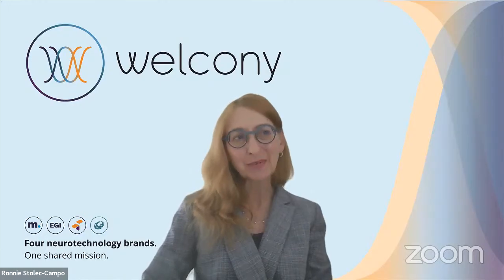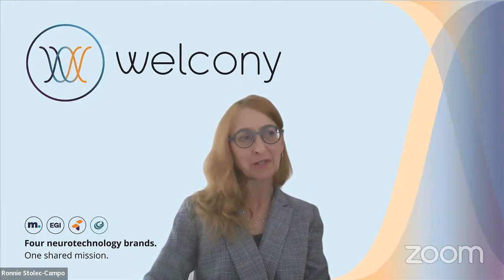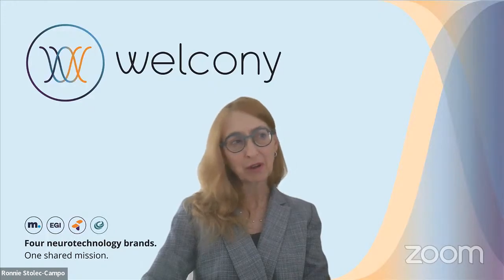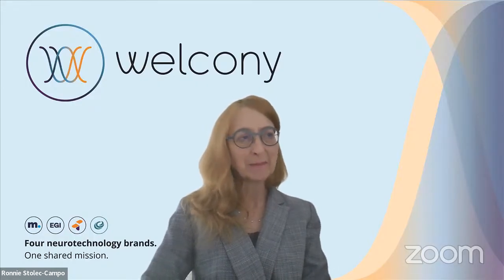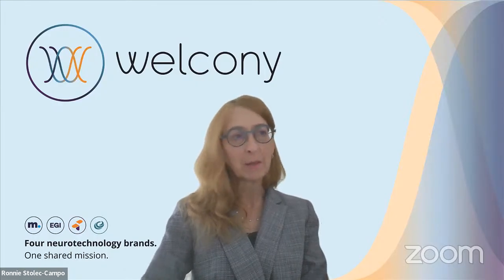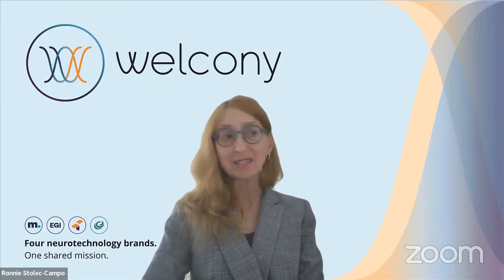Thanks for joining us. We're excited to share this demonstration of the Horizon 3.0 StimGuide Pro. This Magstim system is at work in clinics, hospitals, and research labs, providing integrated, navigated TMS. There's a wide range of treatment protocols and options with the system, and all of our focus is on improving patient outcomes. Today, Joe's going to provide an overview of the basic steps you need to perform a patient treatment and demonstrate just how easy our navigated system can be.